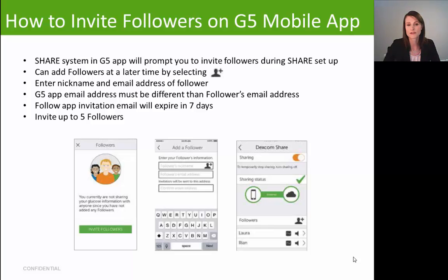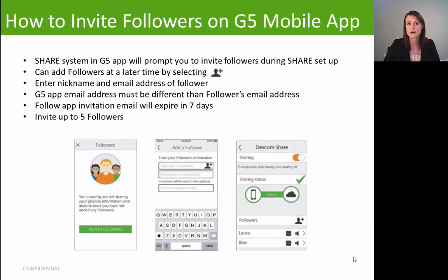When you're ready to set up share, click on that gray triangular icon and the first few screens will walk you through how share works. It will then prompt you to invite your followers by entering their name and email address. It will send your follower an email invite that expires within seven days. Make sure you use an email your follower can access on their smart device, as they'll need to accept the invite and download the Follow app. Also use a different email address than the one you used to log into your G5 app.